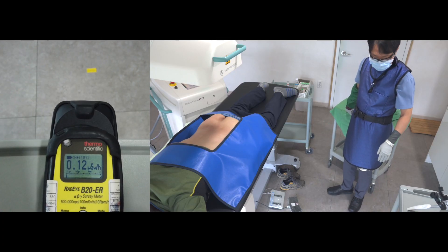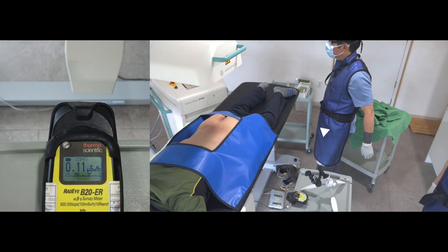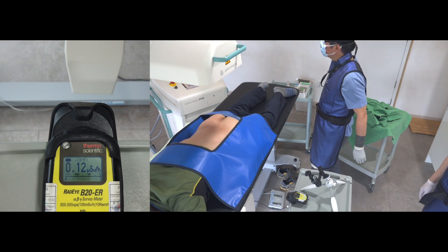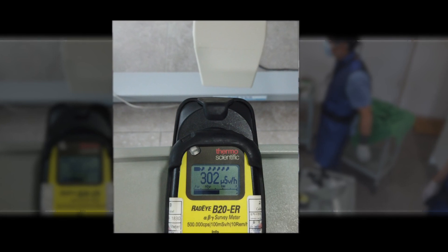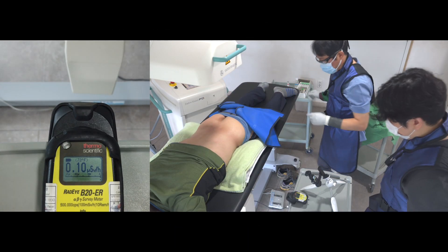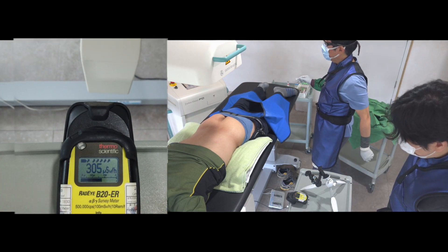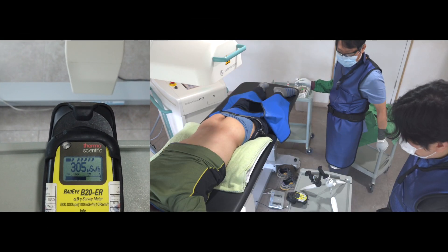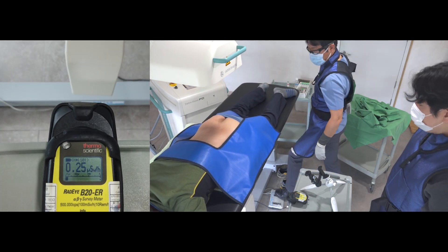This is my first study. I step on the pedal for three seconds for each measurement. Here is the measurement at the pelvic level with the scatter drape, and here is the measurement at the pelvic level without the scatter drape. At the pelvic level, the numbers are very similar.